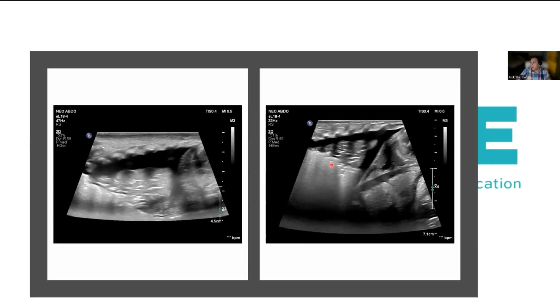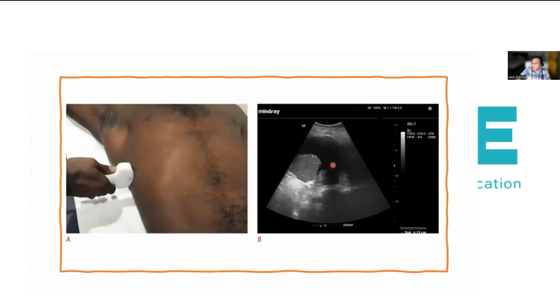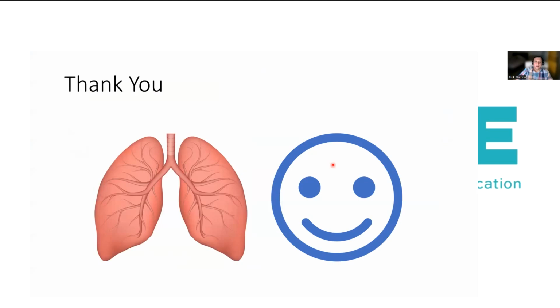So I think that brings me to the end of the talk. What I would like to say to you is that there's absolutely no doubt in my mind that lung ultrasound per se is a very important aspect of our arsenal for evaluating the lungs, not just with regards to pleural effusions, but with regards to the diagnosis of a large number of other conditions.